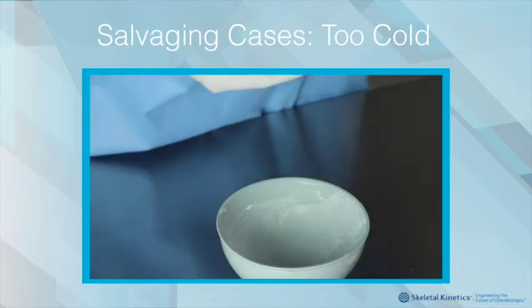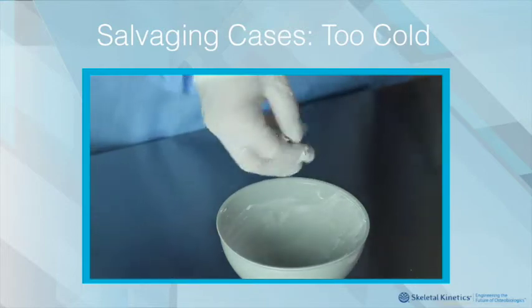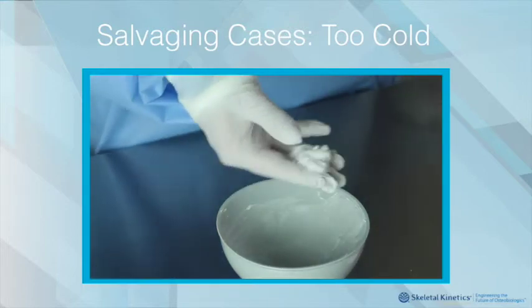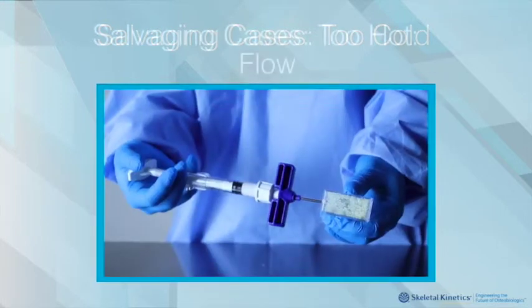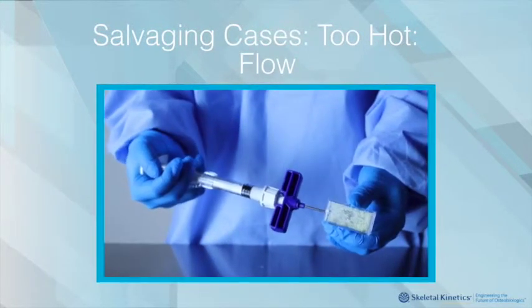Similarly, should this occur with the flow or the injectable product, please have the surgeon wait 30 to 60 seconds until a desirable viscosity has been achieved. In this video sequence, we'll see using scaffold flow in an environment that is too hot for the product.